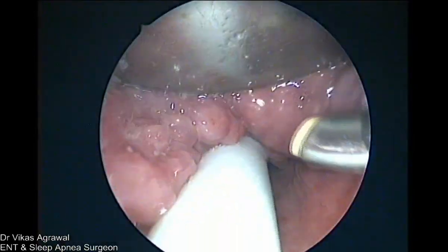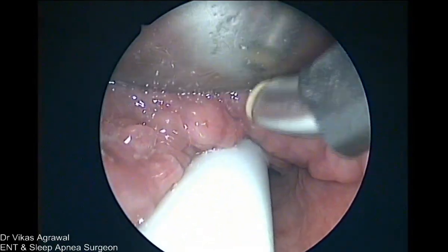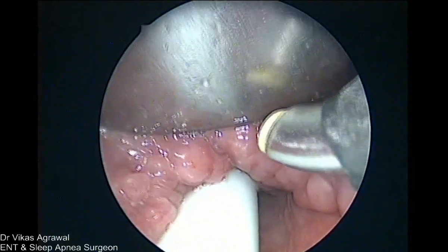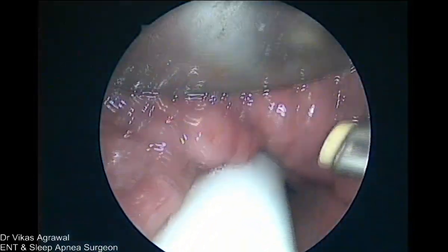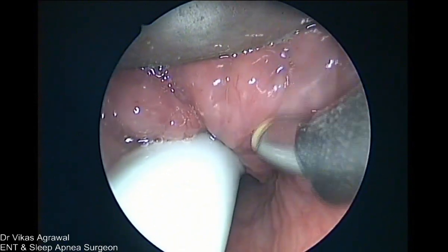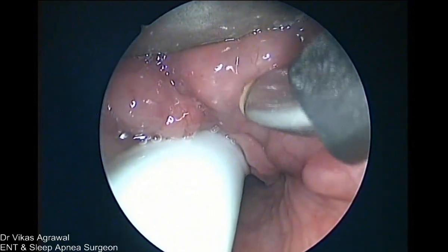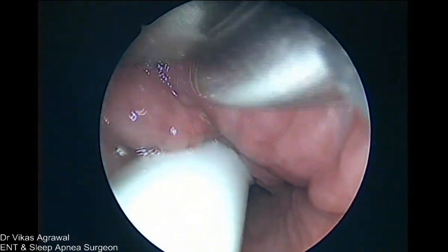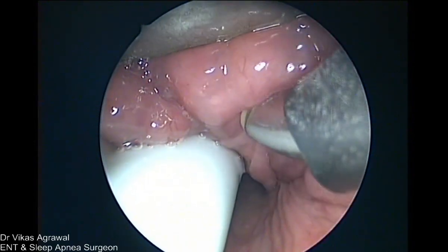Now the setting of the coblation I have changed to 9 and 3. It was 7 and 3. Now I have gone to 9 and 3. So I am holding the camera and the endoscope with my left hand, and my job is to remove all this lymphoid tissue and if required the muscle also, and go into the vallecula.